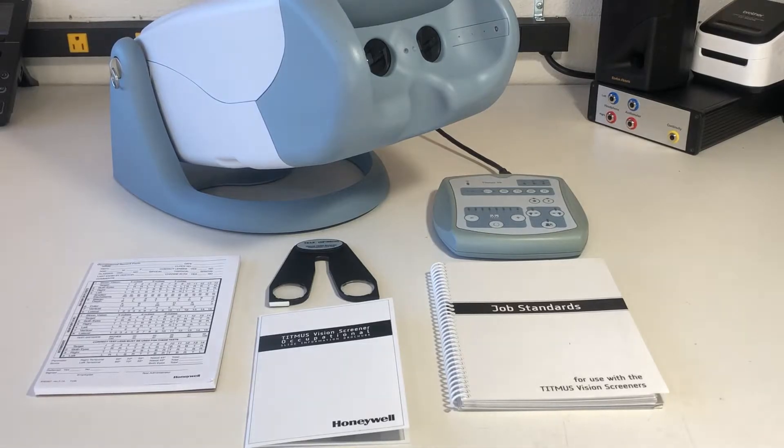In this video, we will be demonstrating how to use the Titmuss V4 Vision Screener equipped with Landolt Ring Slides.